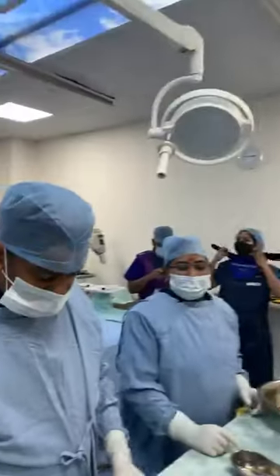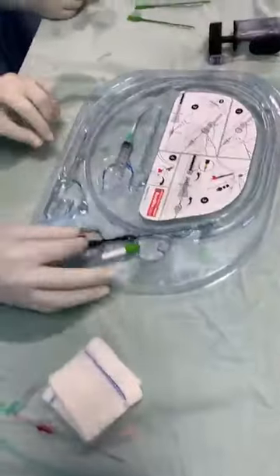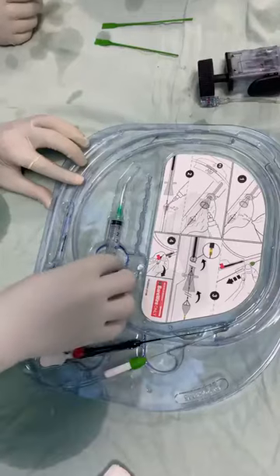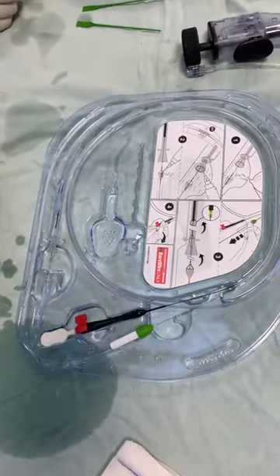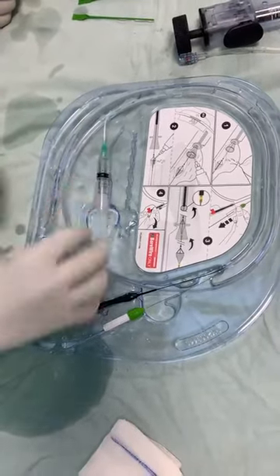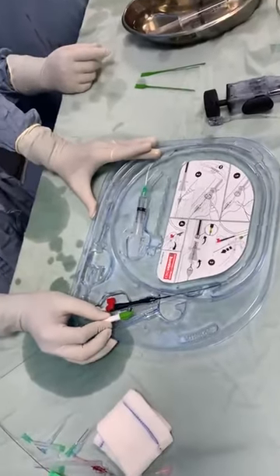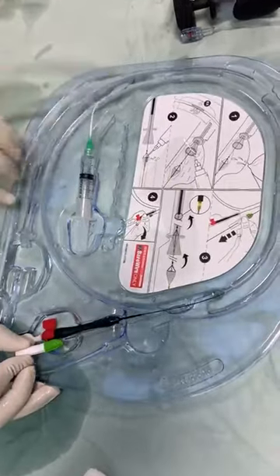All right, so we will see the distal embolic protection. Here we have chosen a NAV6. This is the filter, and we have taken lots of normal saline because we want to take the air out of this filter. Once that is done, we take the filter inside till the golden mark touches the black mark.